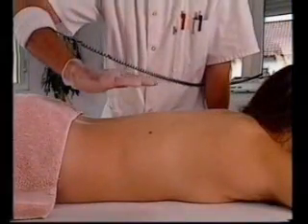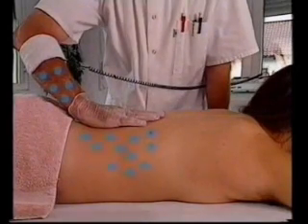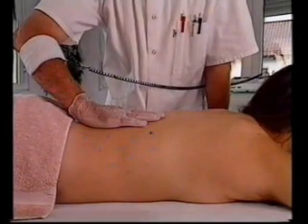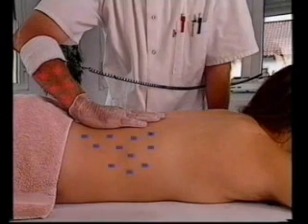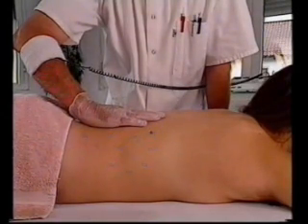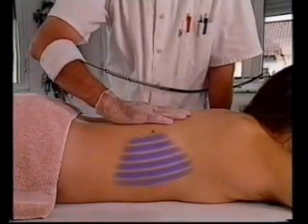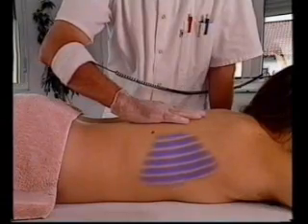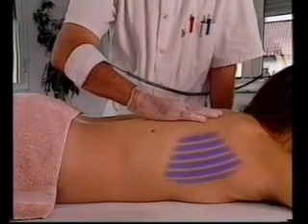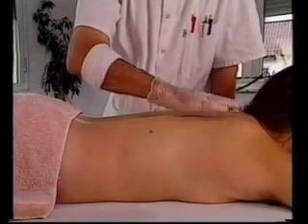The therapeutic effect of deep oscillation is based on the electrostatic field, which is set up between the therapist's hands and the patient's tissue. The electrostatic field is pulsed biphasically. This causes the corresponding tissue to be attracted and again dropped in the rhythm of the frequency selected when the therapist's hands move. This results in a penetrating and enduring resonant vibration of the tissue segment treated.